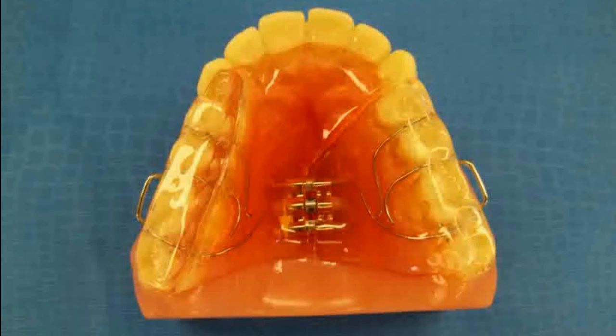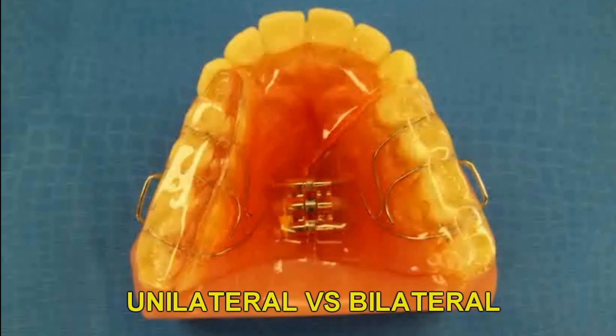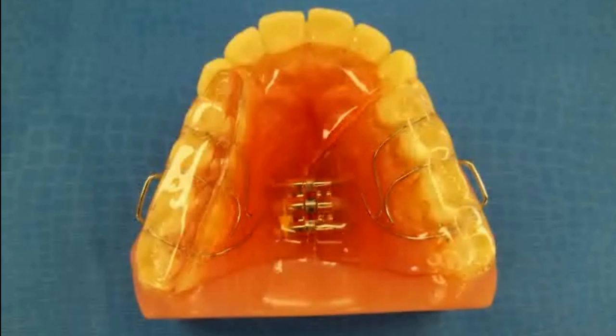To do this, you can use a symmetroscope or observe how the patient opens and closes clinically. Have the patient open about 15 millimeters, then have them begin closing slowly. If the patient closes straight down into occlusion with the unilateral crossbite, then it's most likely a true unilateral crossbite. If the patient closes and the mandible shifts to avoid occlusal interferences, then this is a bilateral crossbite with a functional shift, and the entire arch needs to be expanded.